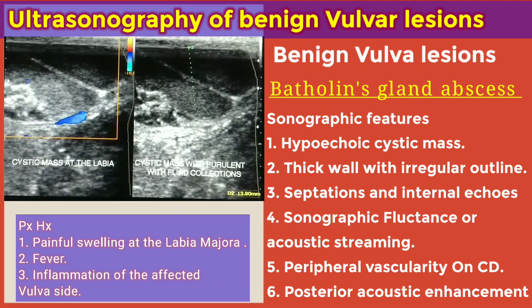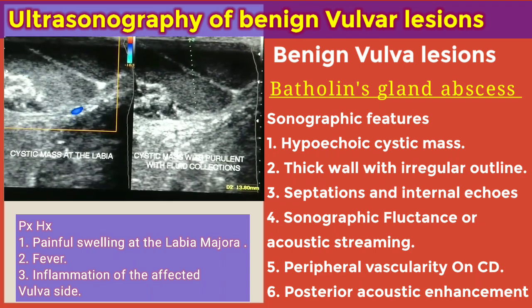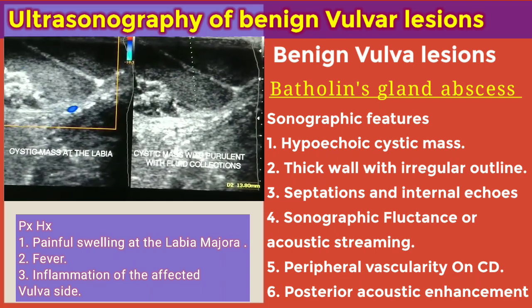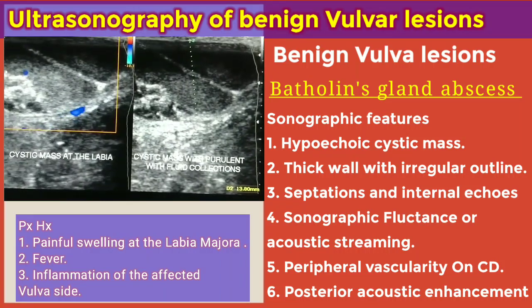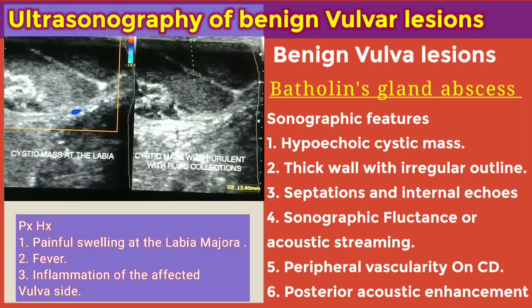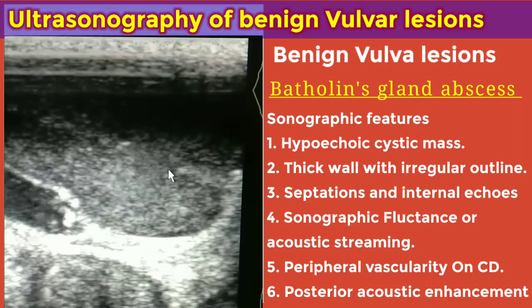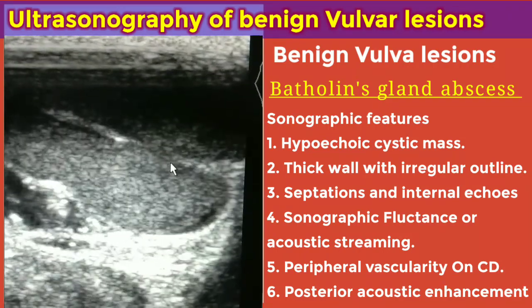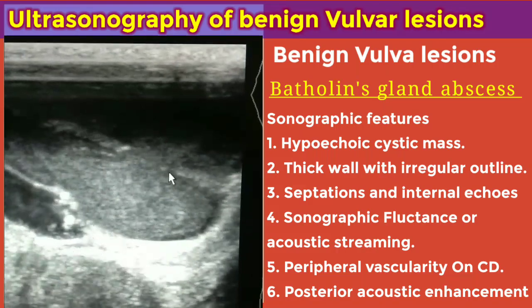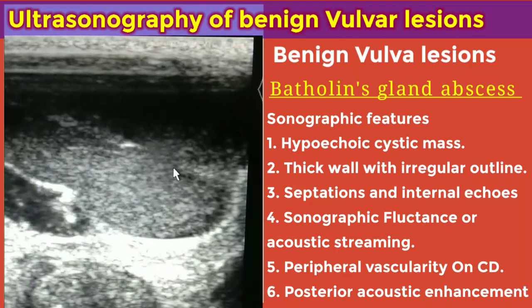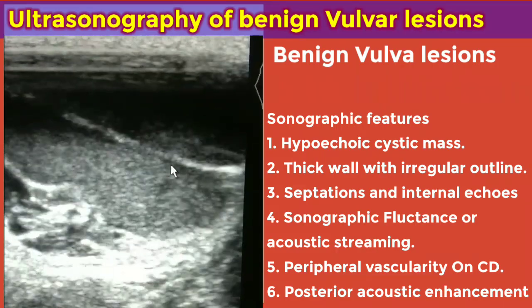This is the video demonstrating Bartholin's gland abscess on color Doppler interrogation. The walls are vascular and there is presence of septations. The arrow here is pointing at the acoustic streaming — the movement or sonographic fluctuance — which represents the movement of the purulent fluid.